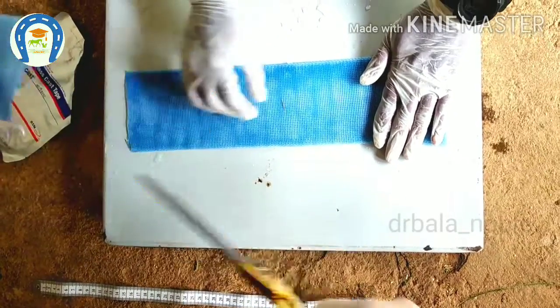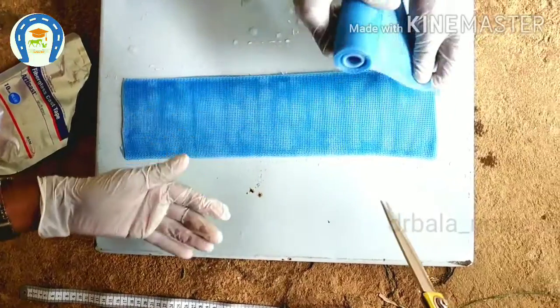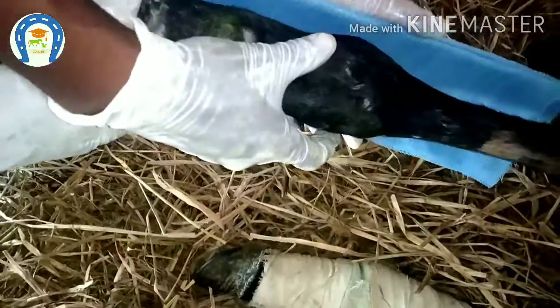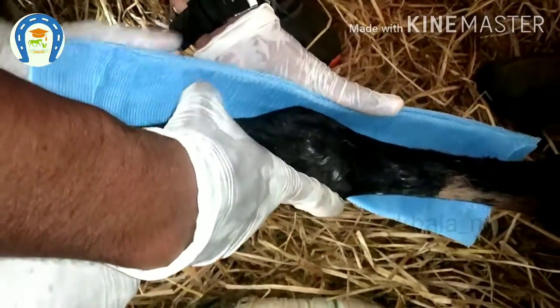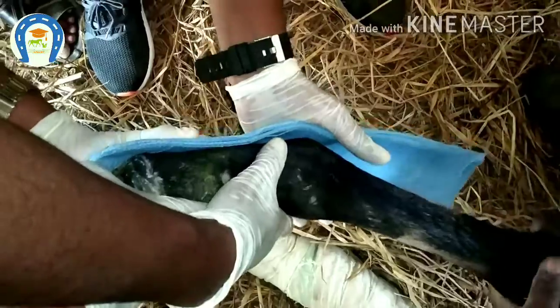After arranging the layers, we have to mold this splint according to the shape or conformation of the part or limb. We cannot use the splint as it is because the affected limb is not straight — there is an angle, so we have to mold the splint according to that angle.